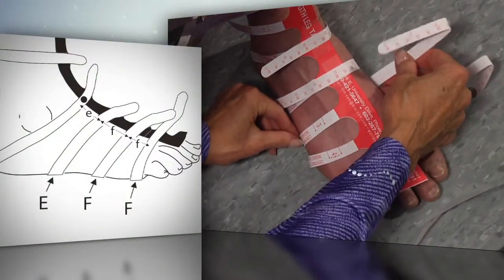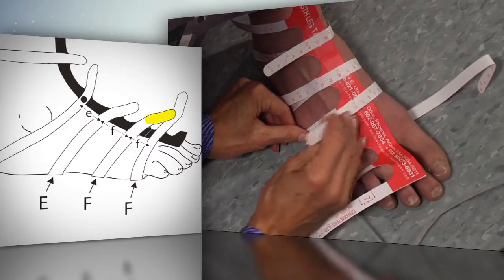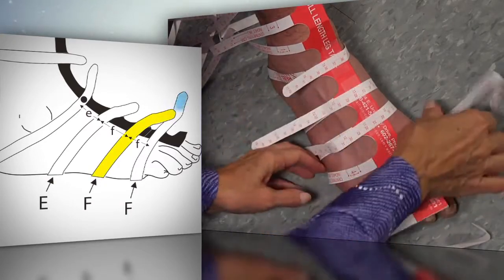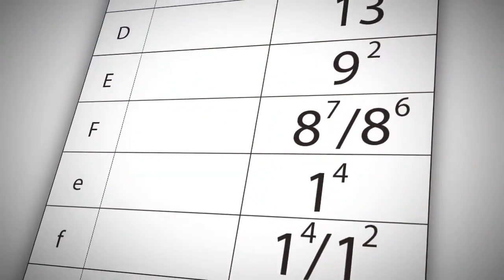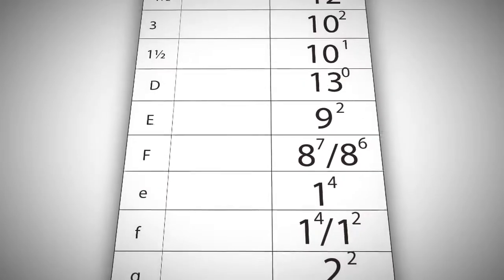In this example, the next 2 straps are capital F circumference measurements. The first capital F measurement is 1.5 inches from capital E. The second capital F circumference measurement is the circumference around the base of the toes. Record both capital F measurements and all the measurements in the appropriate boxes on the foot measurement chart.